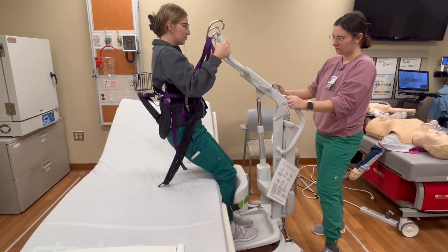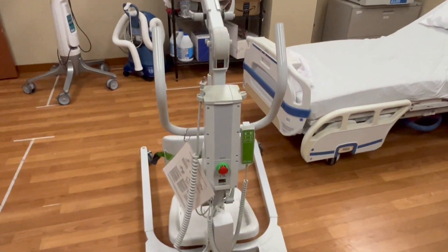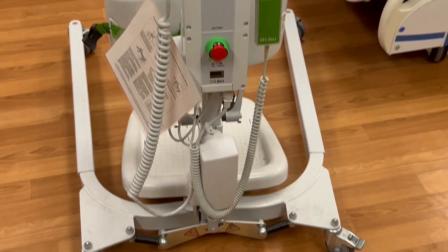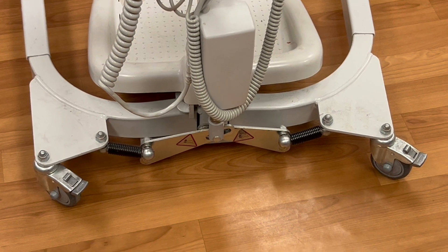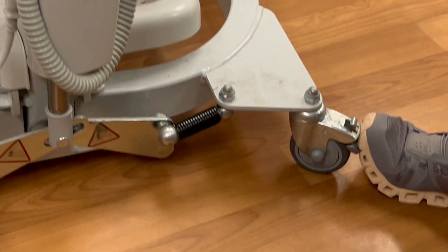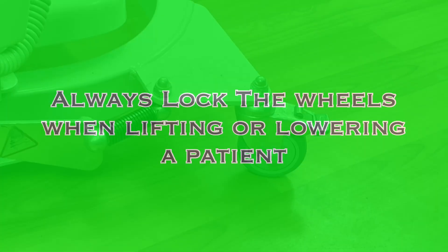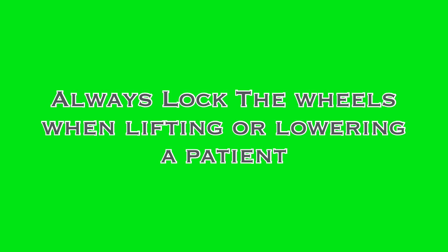The arms will lift and lower to move the patient from seated to standing and back to seated. On the provider side of the device, you have access to everything needed to control the Sabina 2. The wheels on the back of the lift are lockable. Lock them by stepping down on the mechanism. Unlock them by pushing the lifted tab forward with your toe. Whenever you are lifting or lowering a patient with this equipment, you must lock the wheels.